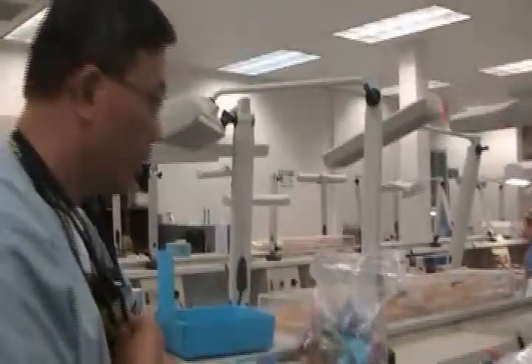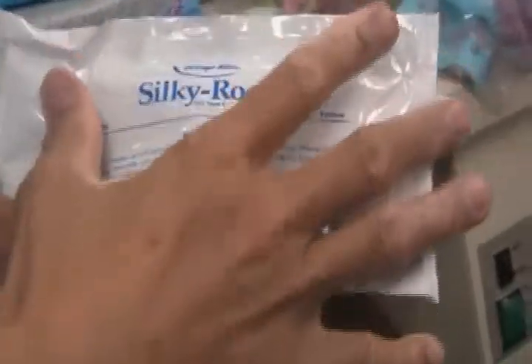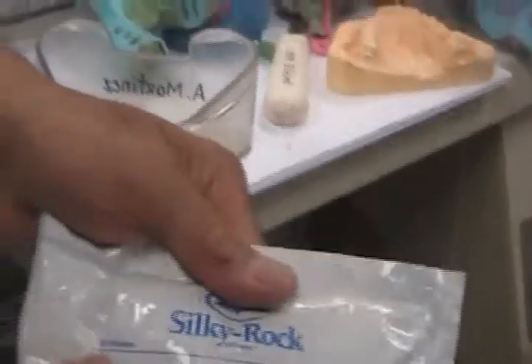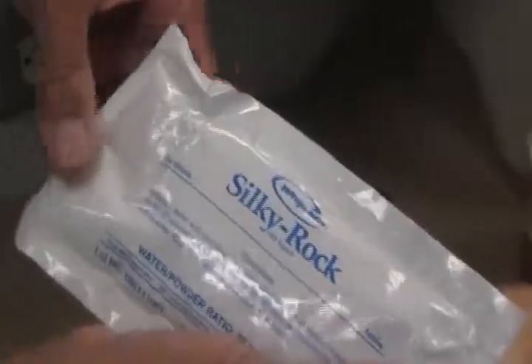We didn't really learn the difference between stones. We just learned 'yellow stone.' So we need to know which yellow is for what purpose. This one is yellow — it's dye stone, for Crown and Bridge. There's another pack in there that says golden. Go ahead and get it. If you just take the time to read each pack, you pretty much know what it's for.